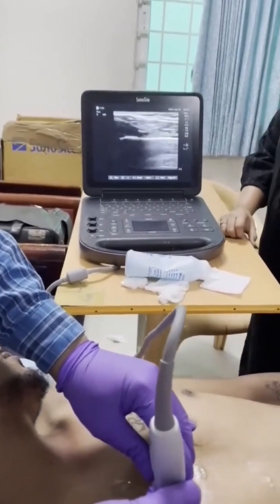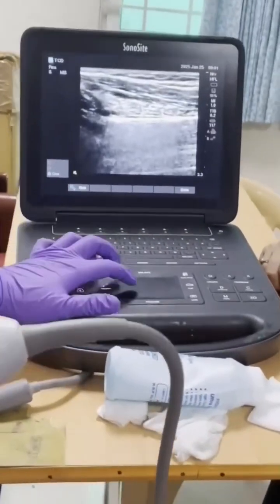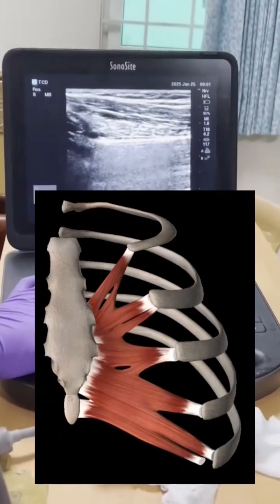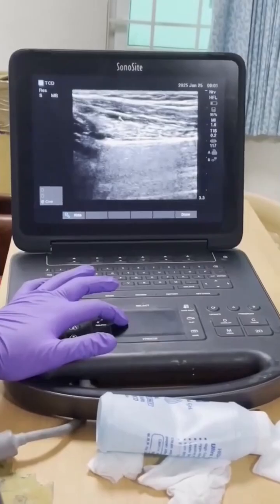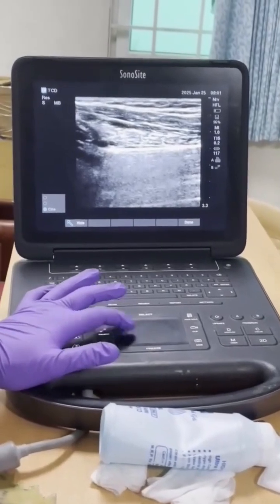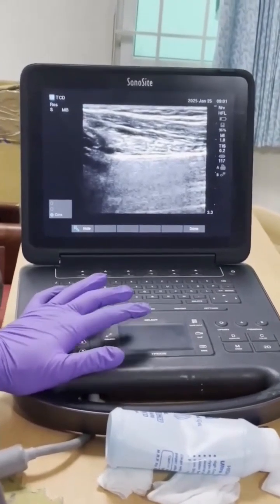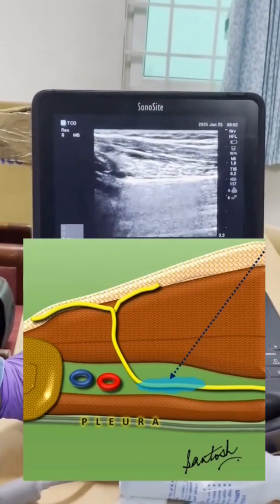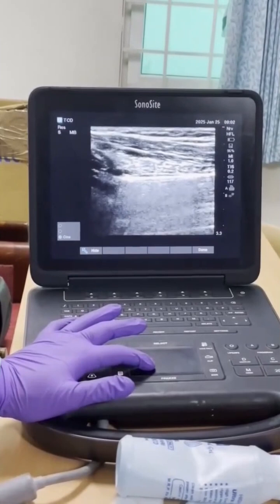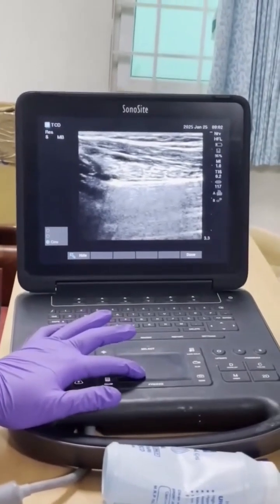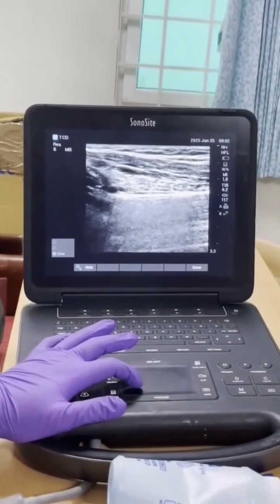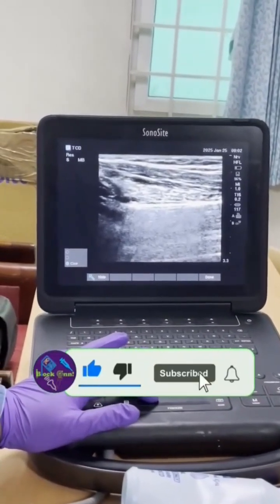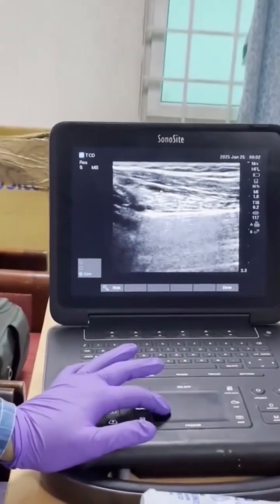At this point, you see a very thin hypoechoic muscle here — that is your transversus thoracis muscle. So if you want to plan to give this deep PIP block, you have to come all the way up to this plane and deposit the drug. Two points: one is it is very close to the pleura, and the second is it is very close to the blood vessel. So if you are using it for midline sternotomy and you damage this artery, then the surgeon will not be able to take the internal mammary artery graft. That is why you must perform in this transverse orientation, and instead of the deep block, you can perform the superficial one.